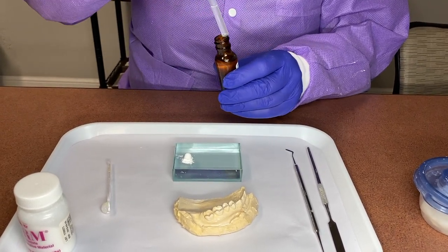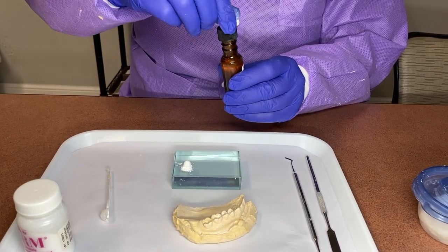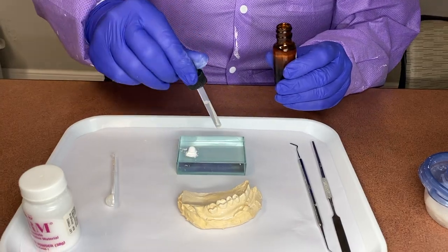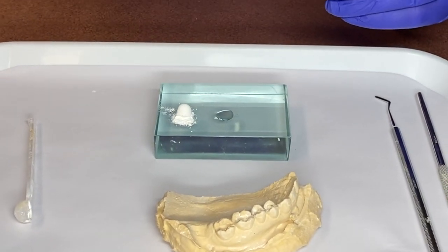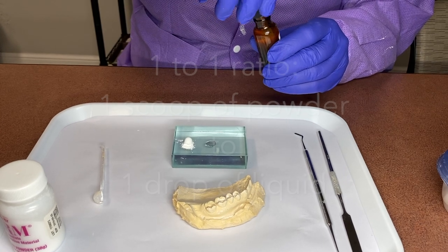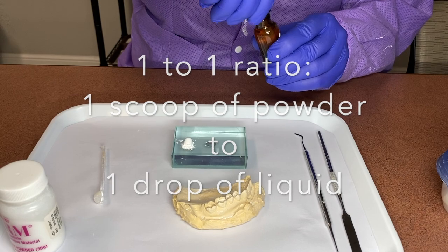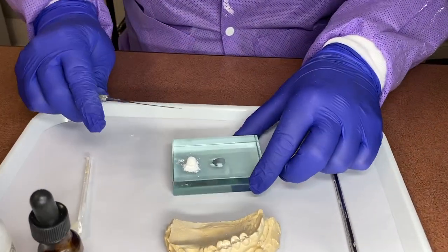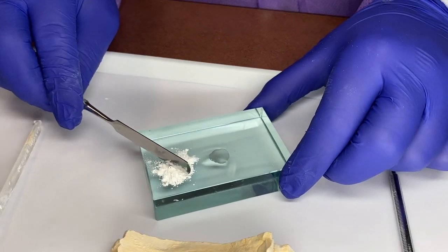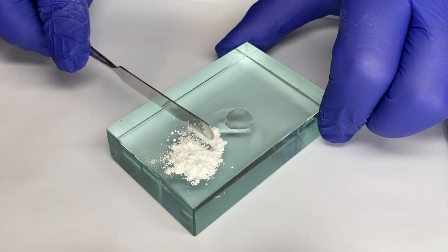And the oil. This dropper is calibrated so you don't have to squeeze it too hard. So I'm gently going to just put a drop here. You can always add more if you need it, and then I'm going to close this back and just set it over to the side. I'm going to gently mix the material, make sure there are no hard spots in it, and slowly pull some of the powder into the liquid.